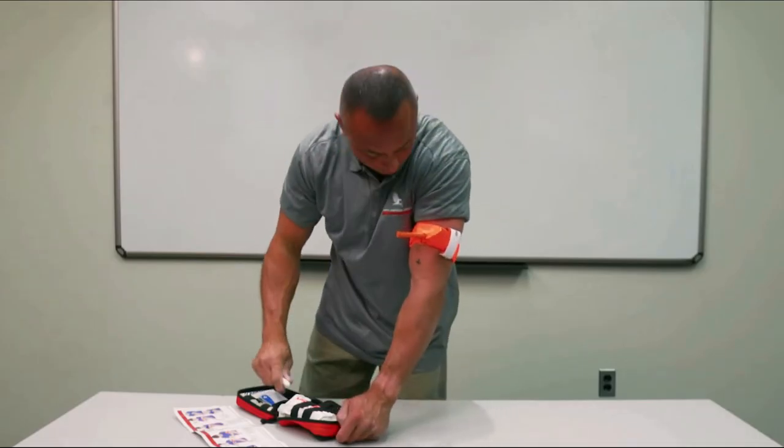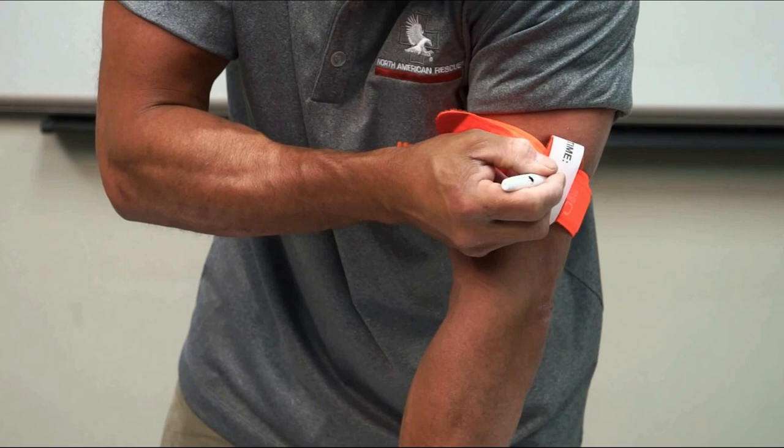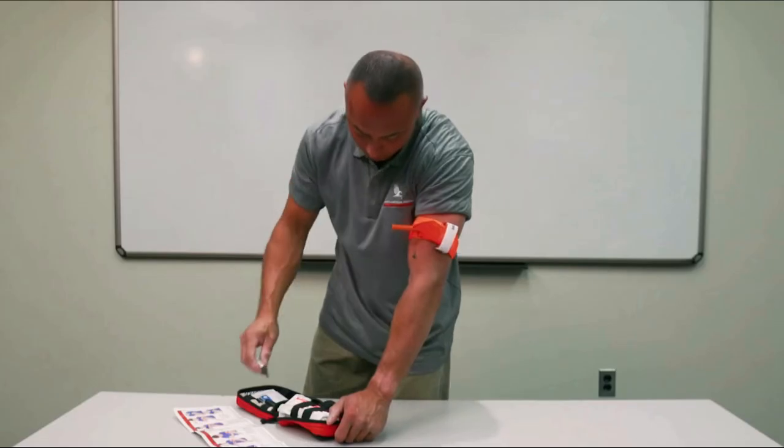If able, record time of application on the time strap with the permanent marker included in the kit.